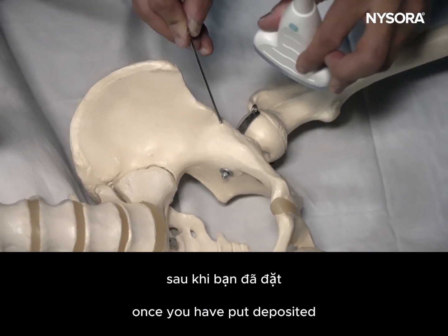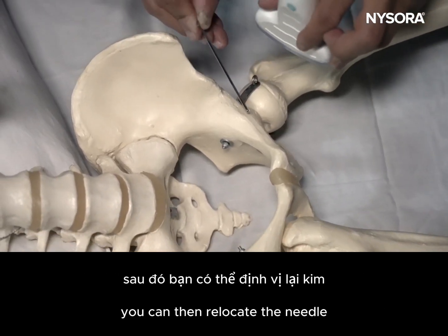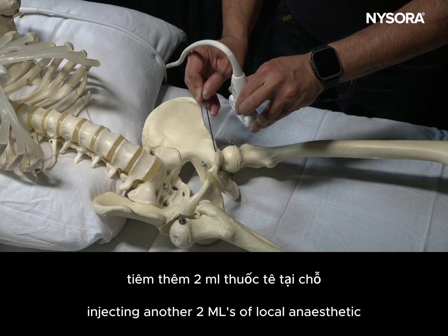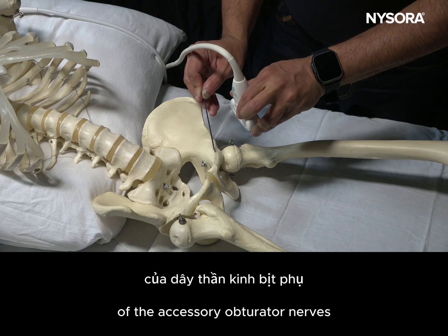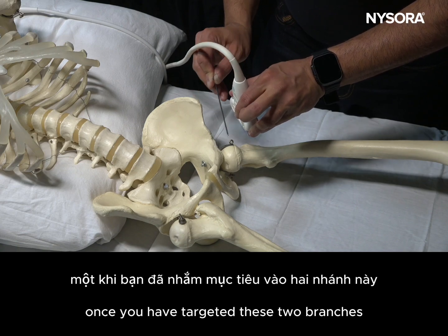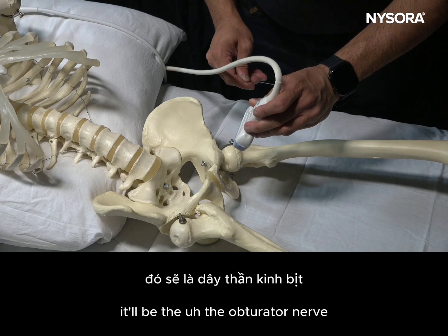Once you have deposited 2 ml of local anesthetic for the diagnostic block, you can then relocate the needle medial to the iliopsoas tendon, injecting another 2 ml of local anesthetic for the diagnostic block of the accessory obturator nerves. Once you have targeted these 2 branches, the next one will be the obturator nerve.